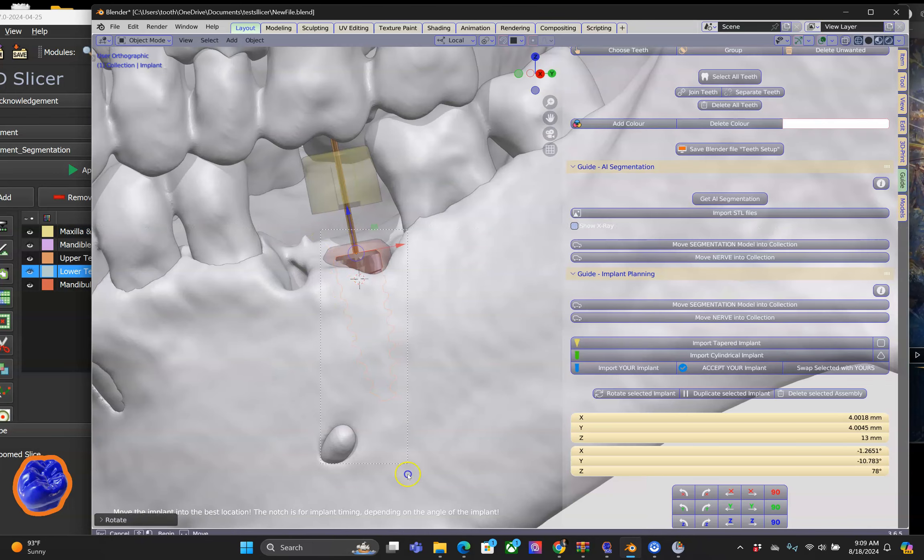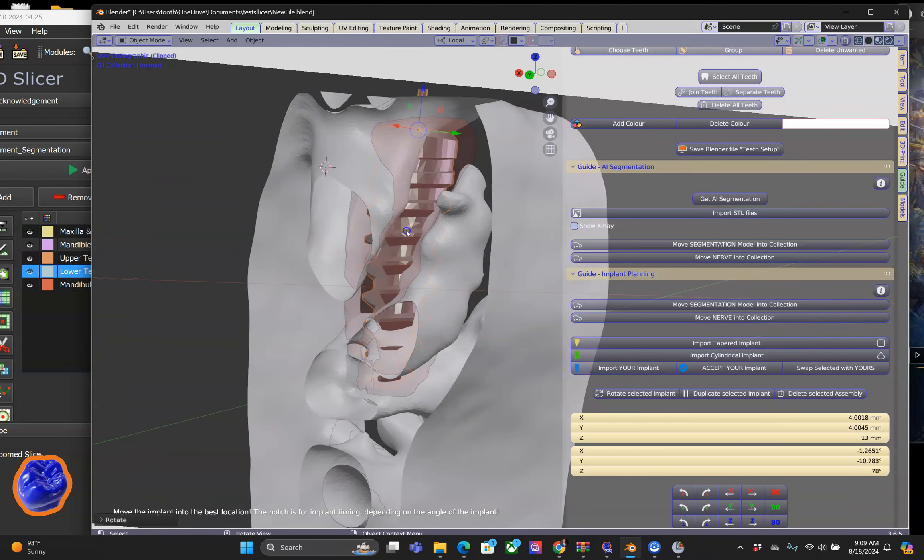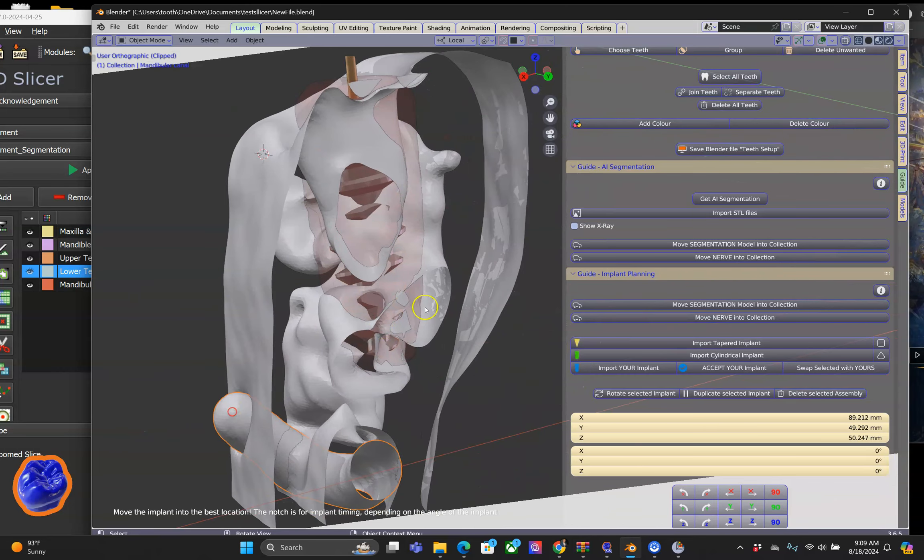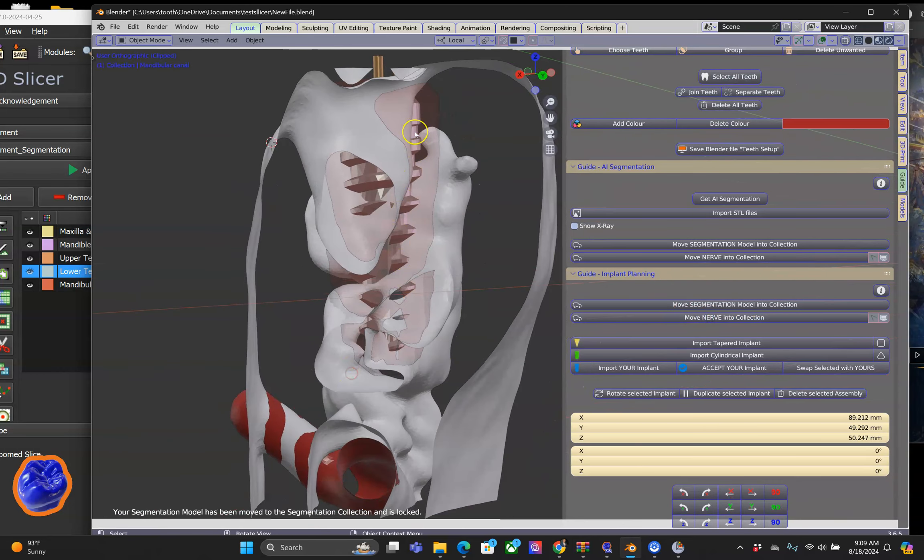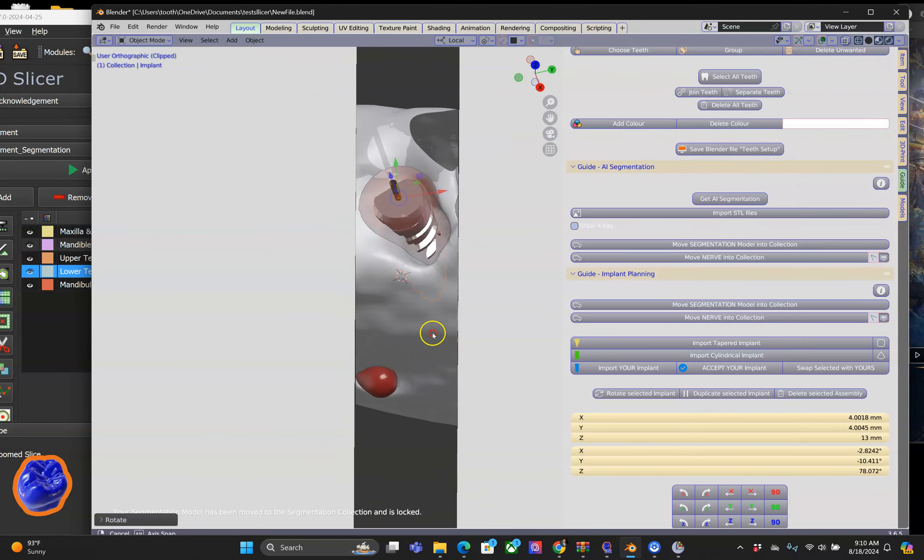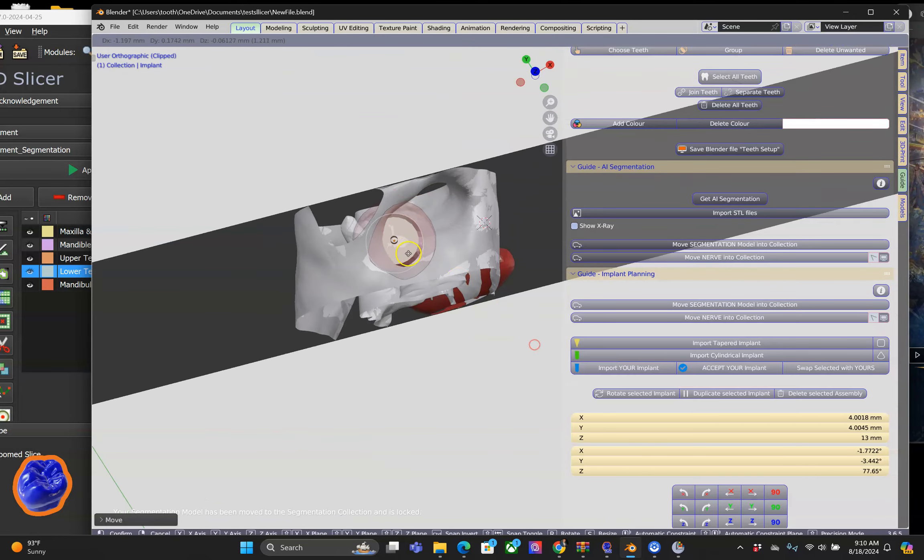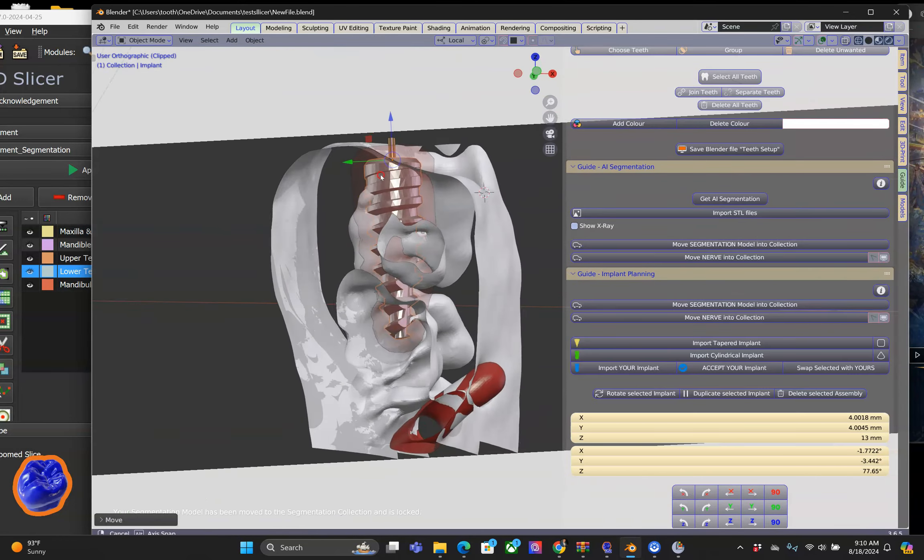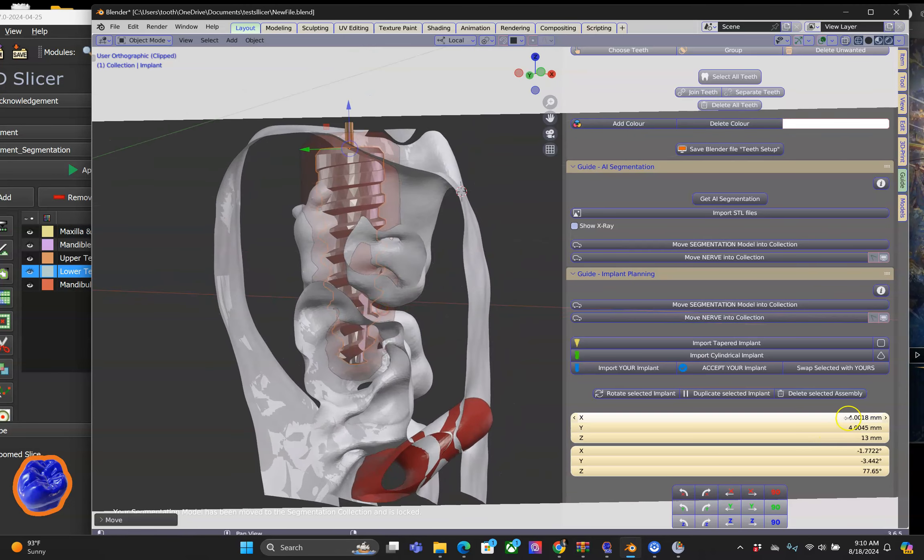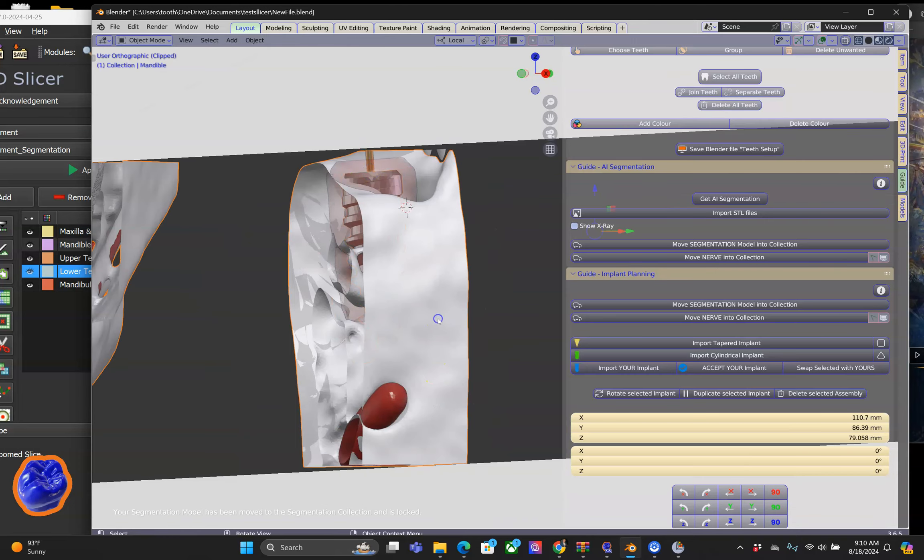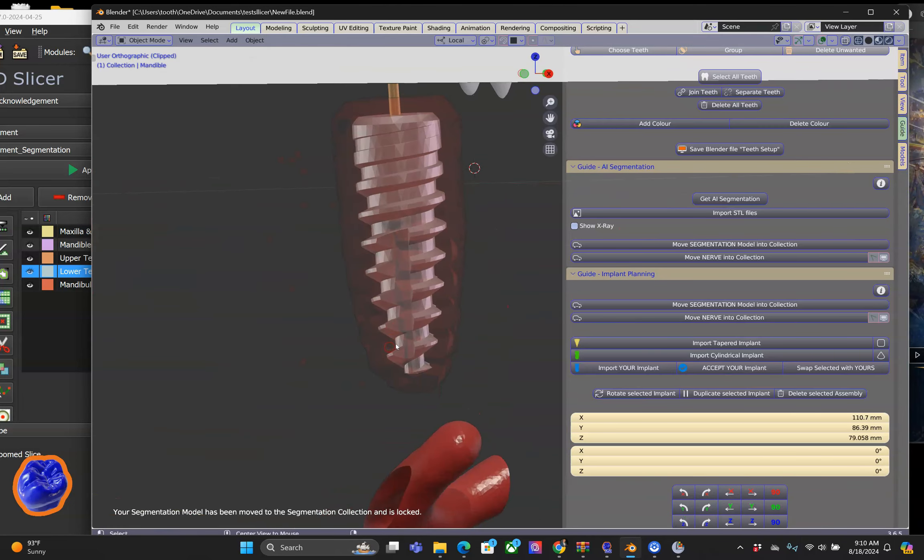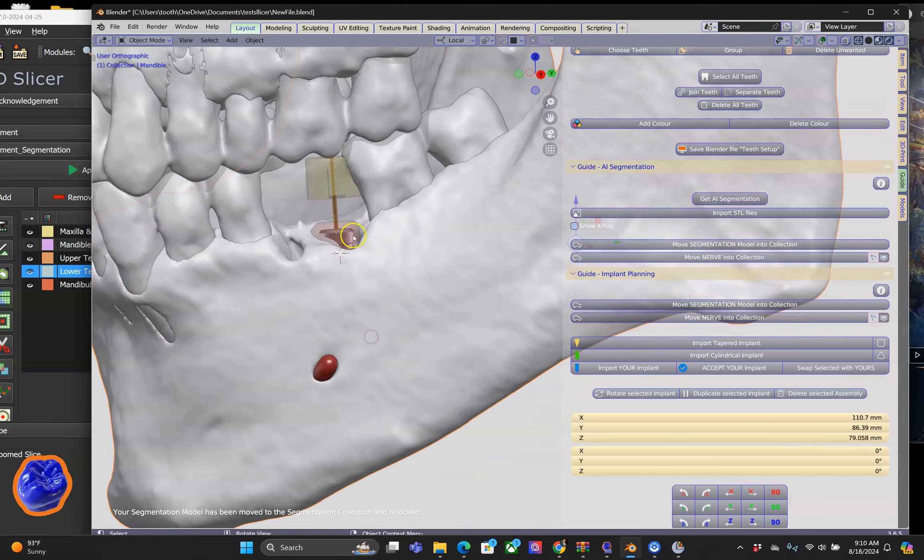Then in Blender we can view a cross section which gives us an internal view of the bone structure. This is a really good feature that we have in Blender, and perhaps other programs have it, but the graphics in Blender are truly remarkable.